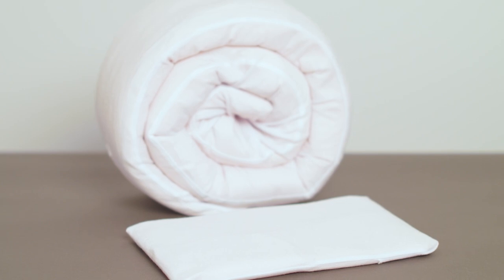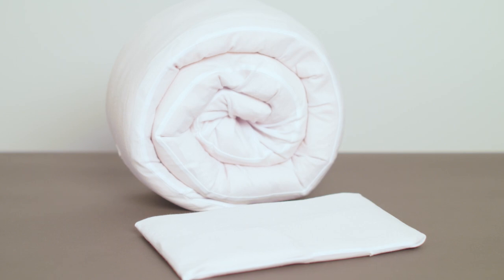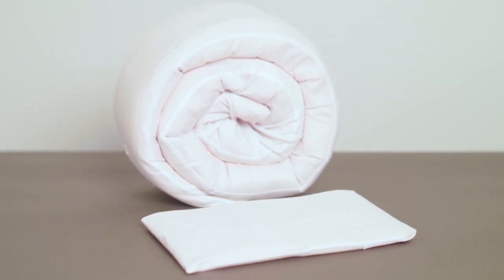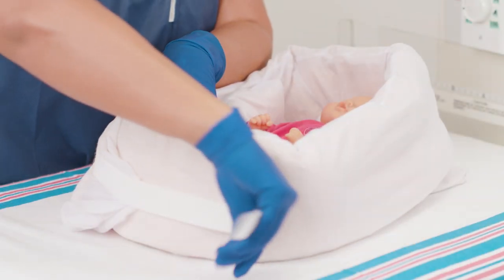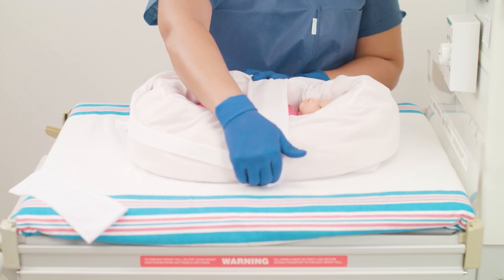The fluidized positioner tube offers advantages over the traditionally used folded towels or pillows. Like other positioners, it should always be used with the included cover. The tube includes an attached strap plus two separate straps that can be affixed to maintain the positioner's shape in the heat of an incubator.